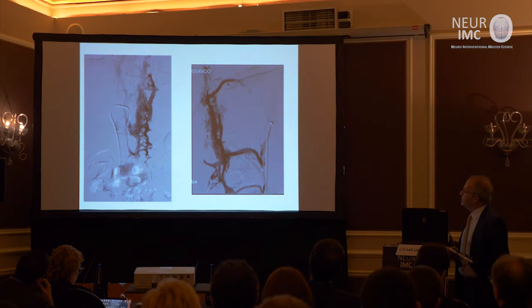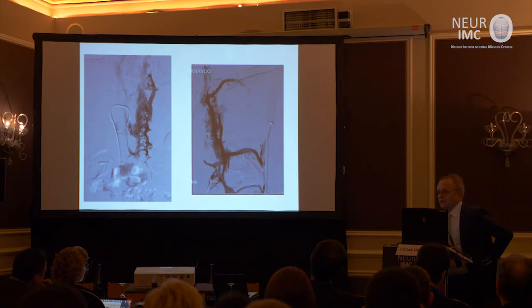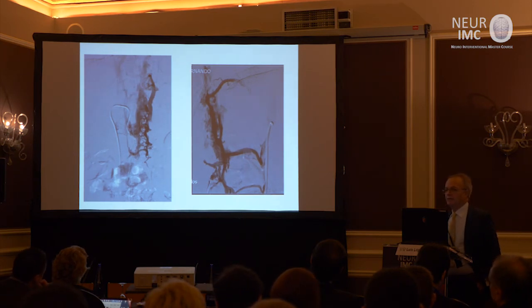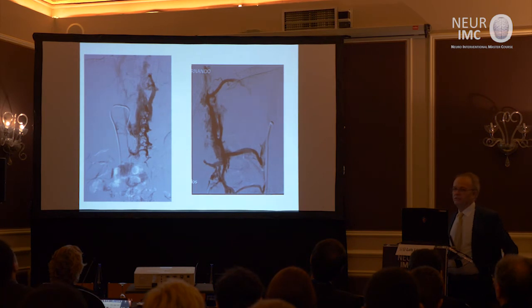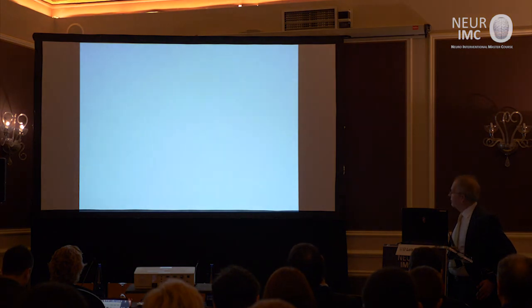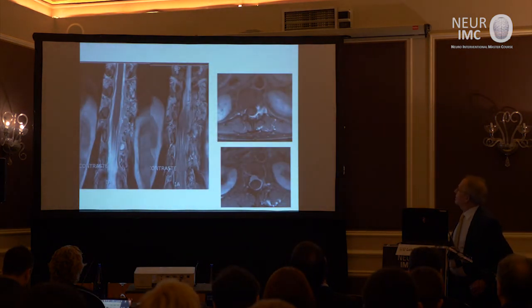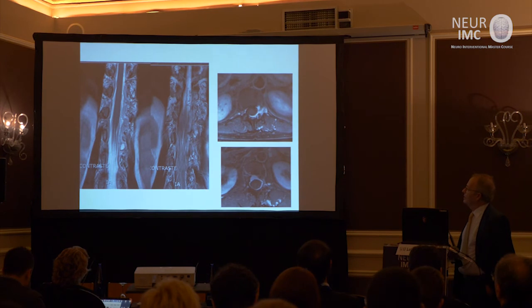Sometimes bleeding. Okay. And this is the example of Dr. Saatci. One patient was treated 20 years before for a superficial venous angioma by plastic surgery, and on the MR you see hypertrophy of vessels around the spinal canal. Okay, this is the magnetic resonance. You see some vascular imaging around the canal, and the patient has very high dorsal pain, very difficult to treat.